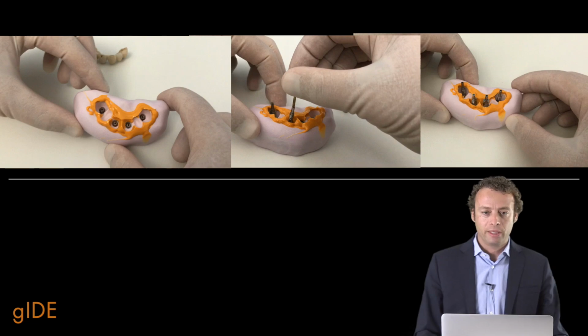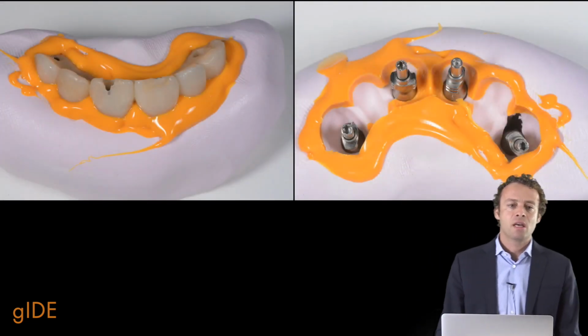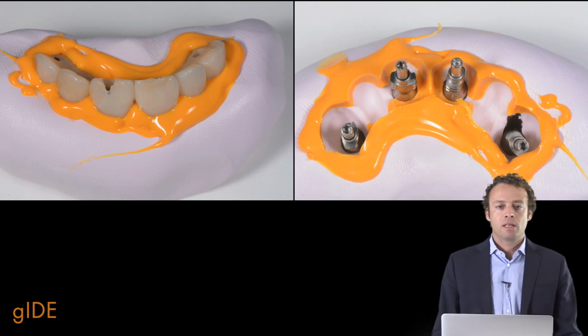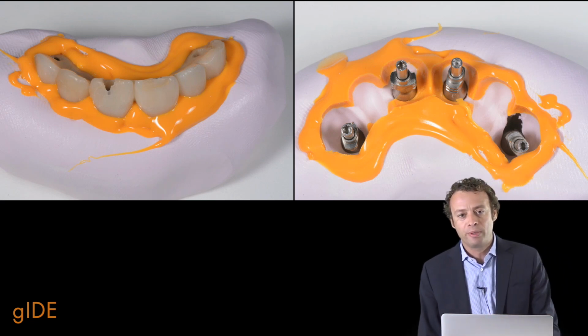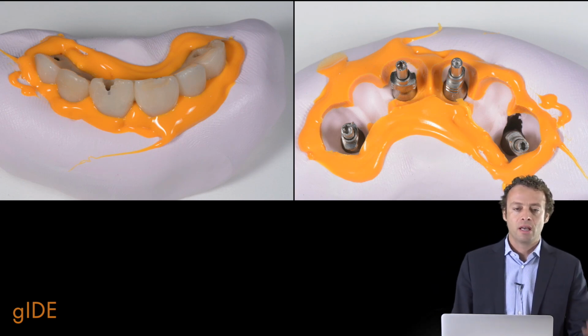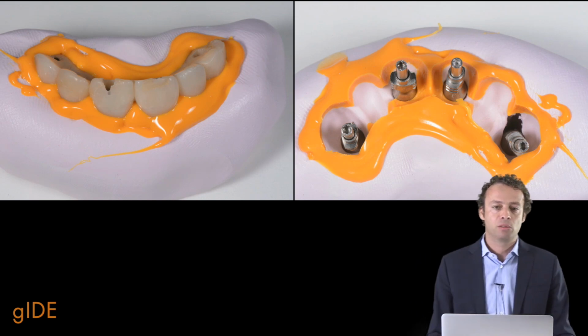and without the necessity to cut the silicone key intraorally. In these pictures we can see in detail what we have done. So we have copied the subgingival portion of the temporary. Then we connect the impression coping inside the silicone index using the dedicated impression coping in relation to the implant system that we used.